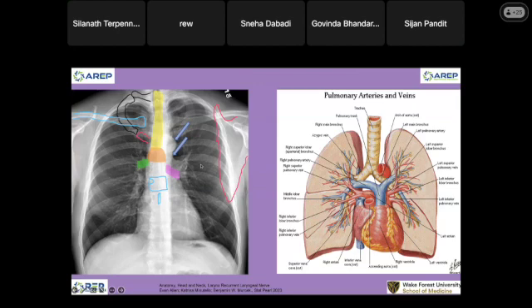So we talk about the hoarseness. People who came in with hoarseness, like head and neck cancer, and has hoarseness. All right, and then when we scan the patient, we don't stop at the neck. We go down to the hilum. And let's do the airways and see this space, because from that space I have the recurrent laryngeal nerve.